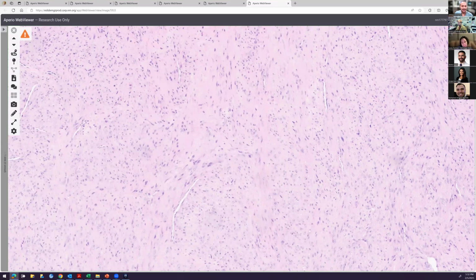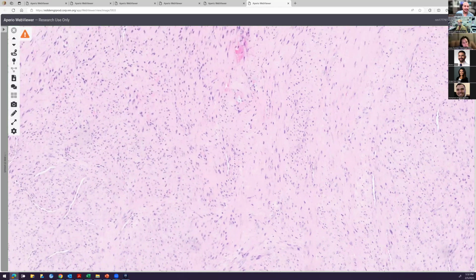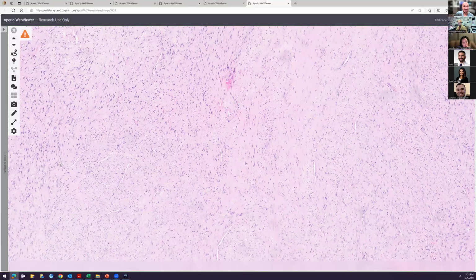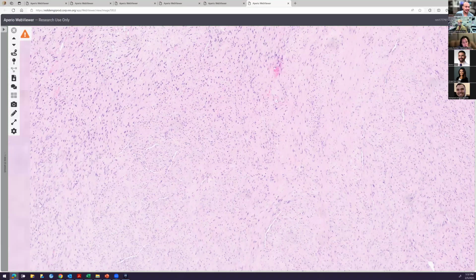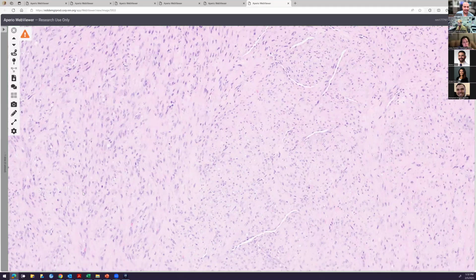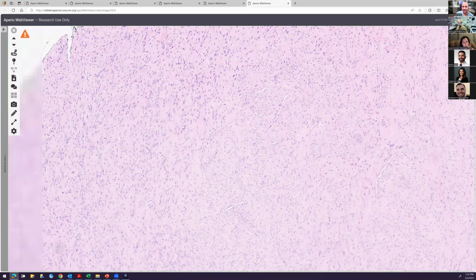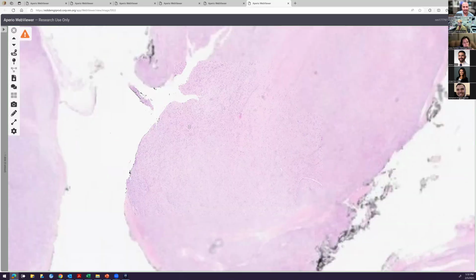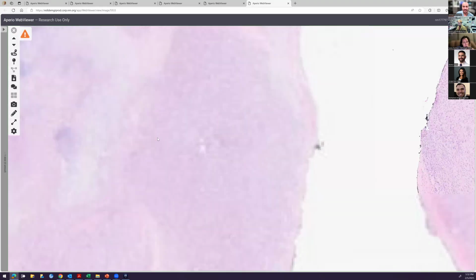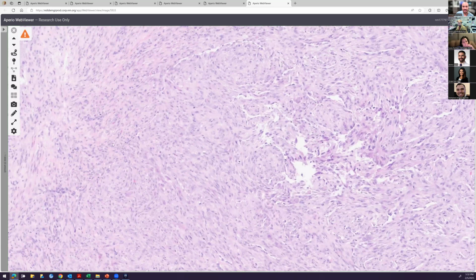I think this is short fascicles. I feel like I'm seeing cross sections of short fascicles. Yeah, kind of getting some short fascicles. Okay, fair enough. Vessels kind of look compressed. Yeah. And maybe thick walled. I'm not sure. The little guys here, some vessels, right? That's true. Let's take a look at another piece. It's fairly bland. It is at the margin, whatever it is. Very bland, but quite cellular, right?